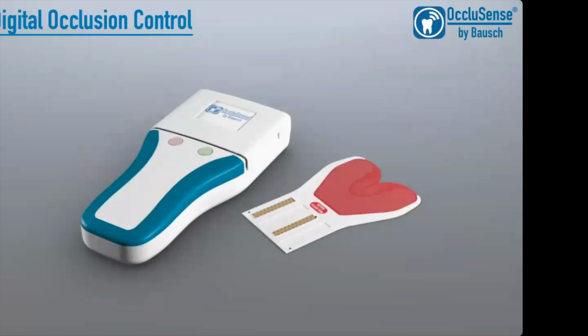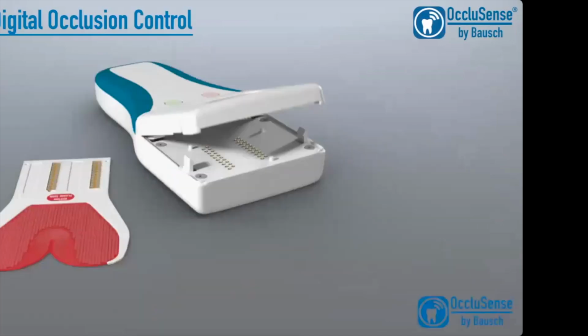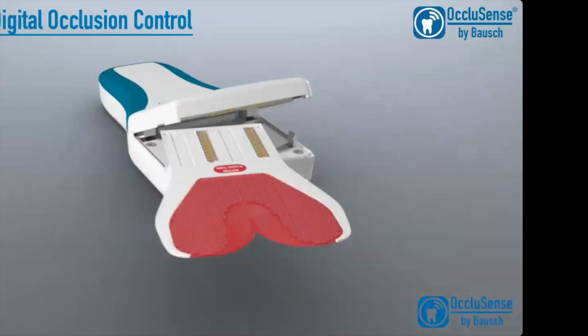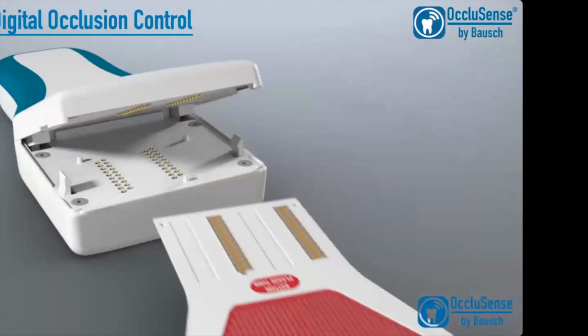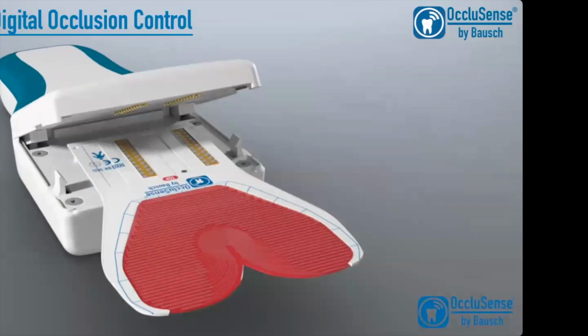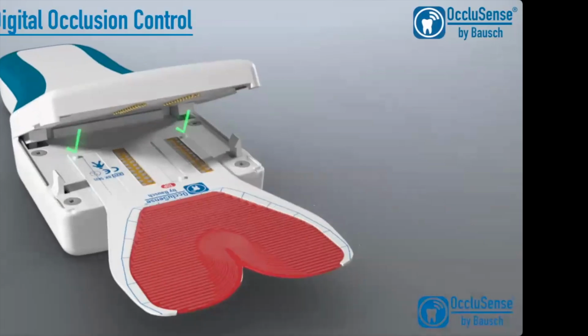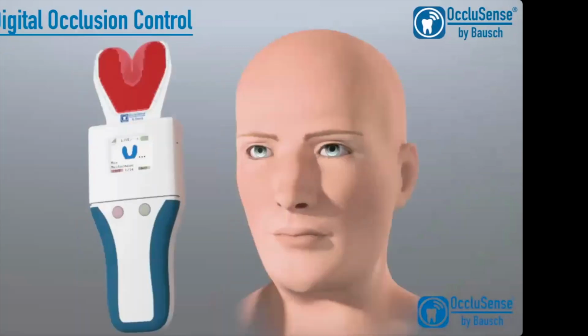and it consists of this handheld, an electronic pressure sensor, which you then insert into the handheld. This can only be inserted the correct way around due to asymmetric pins and holes in the handheld and in the sensor. So once you have inserted this correctly, you are able to then close the sensor. It will make a little clicking noise, and then you're able to get started.